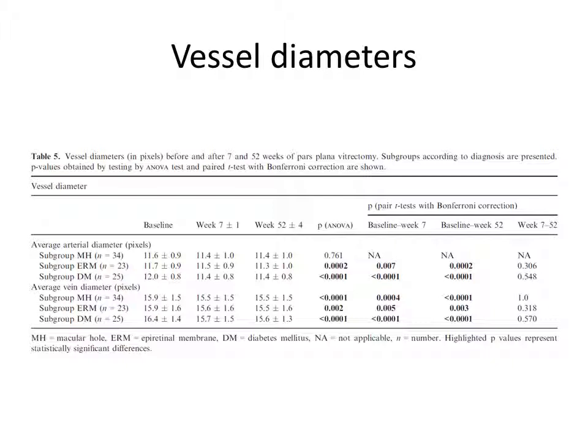We don't know why in this case it's different, but in all other cases there is a slight narrowing of the vessels, and it could indicate improving tissue saturation. So probably even in diabetic patients, even if they do not have an increase in saturation in the retinal vessels, the tissue saturation looks increased in this group.